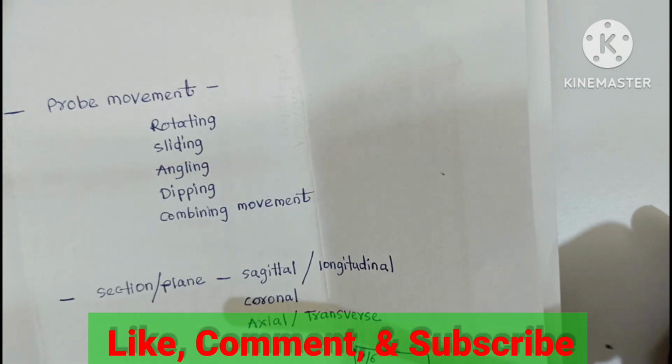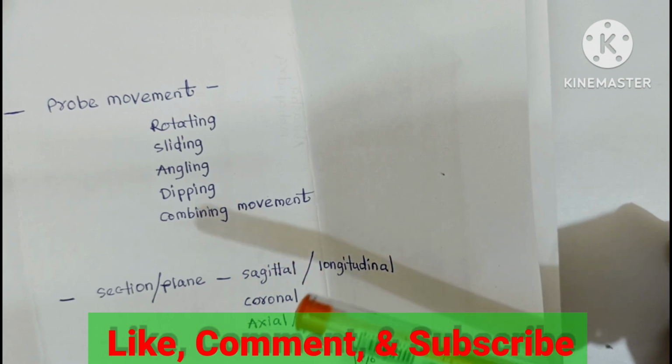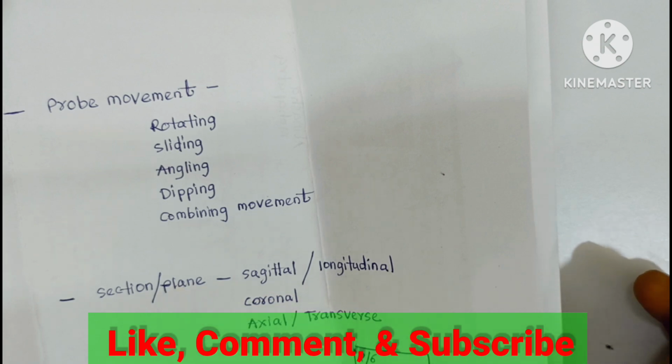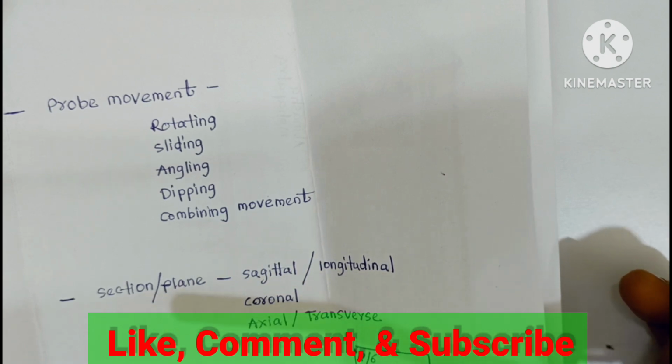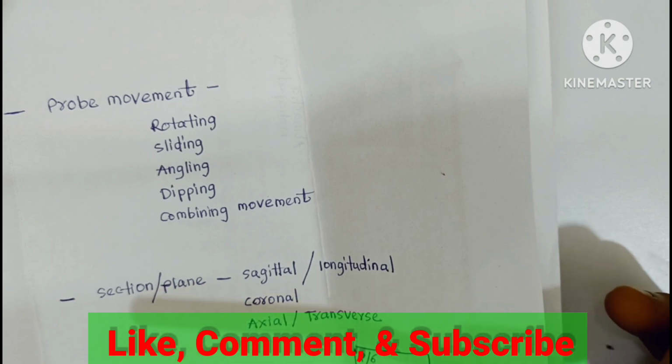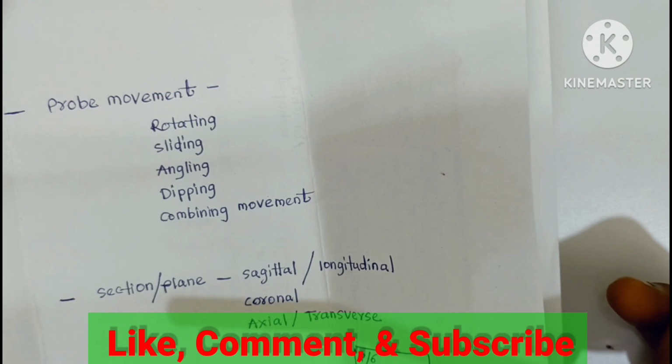During sliding of the probe in the narrow axis, it brings the target to the middle of the screen. But sliding in the broad axis is used when we want to acquire serial transverse sections of the targeted structure. Remember, sliding along the narrow axis brings the target to the middle of the screen, and sliding along the broad axis acquires serial transverse sections of the targeted structure.